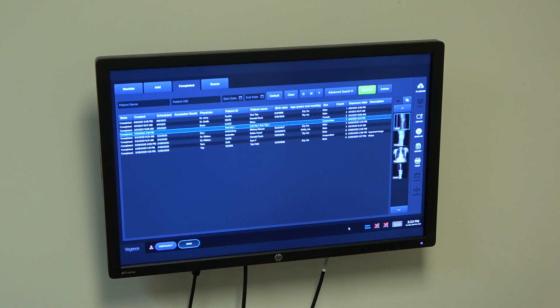We'll put one permanently in the wall stand, and then we'll run the one micro USB cable to the panel that will power it up. So we're not communicating through that cable. We're only powering the panel up so that you don't have to change a battery, but it's still communicating with the wireless router. If you need to pull it out to use it in the whole room, then you simply unplug the one micro USB connection, take the panel out. It's already connected to the router, so it's a very quick and simple, true hybrid solution.